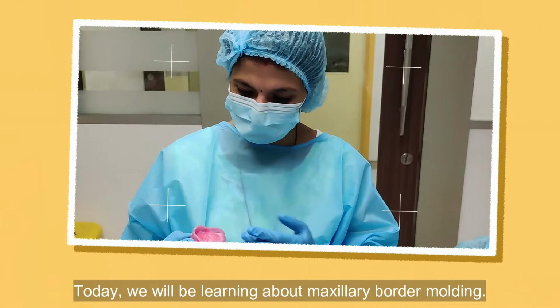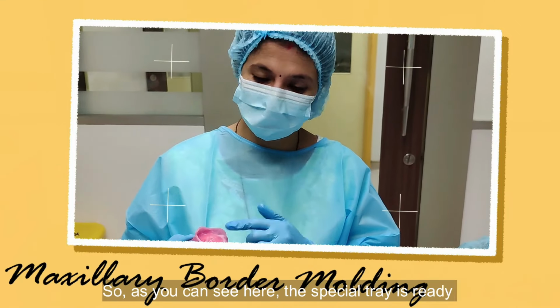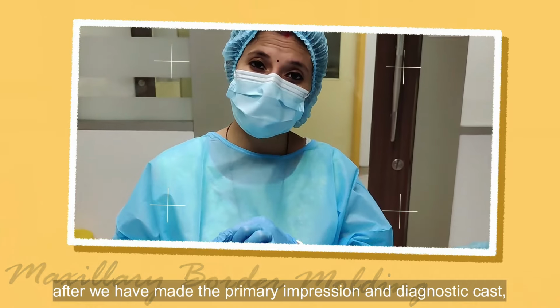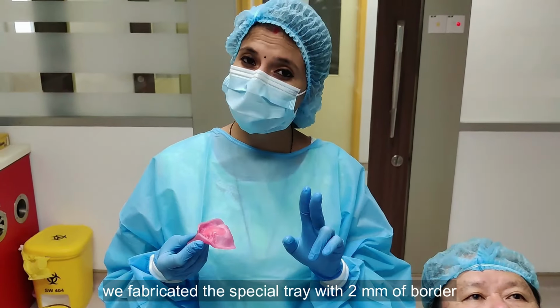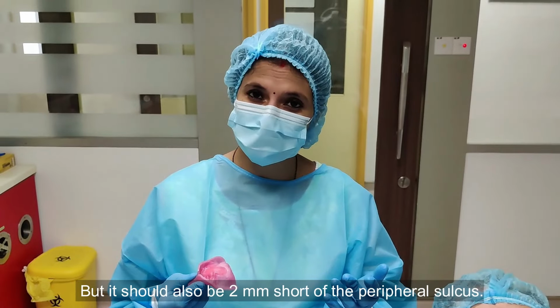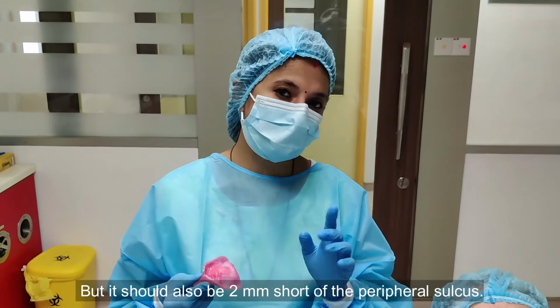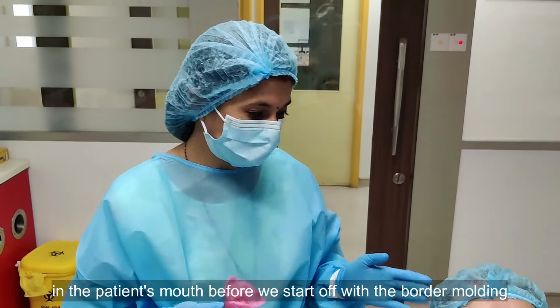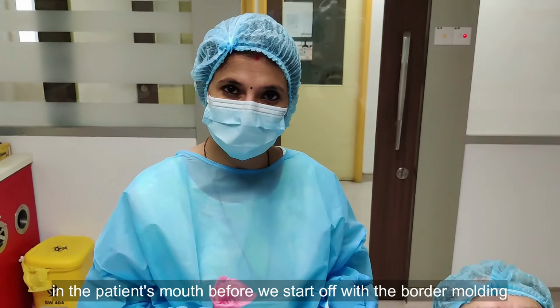Today we will be learning about maxillary border molding. So as you can see here, the special tray is ready. After we have made the primary impression and the diagnostic cast, we fabricated the special tray with 2 mm of borders, but it should also be 2 mm short of the peripheral sulcus. So that is what we need to check in the patient's mouth before we start off with the border molding.